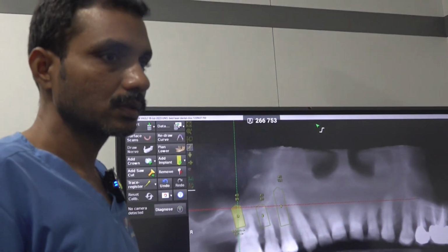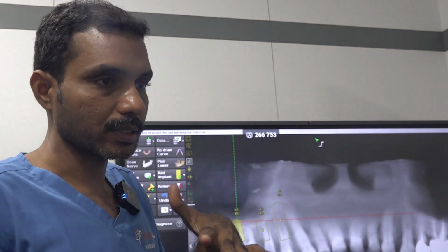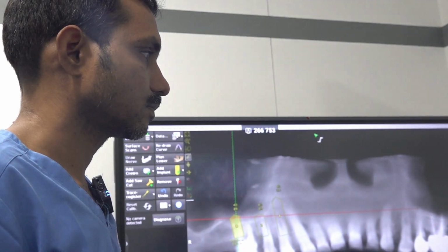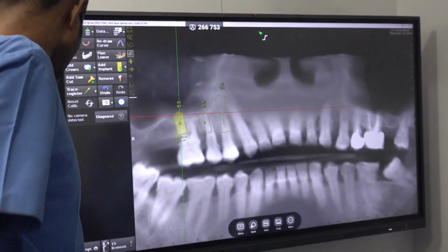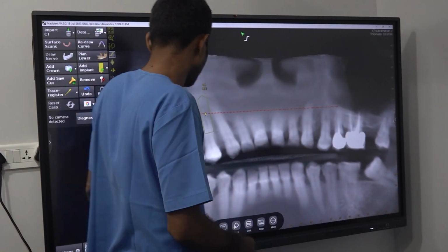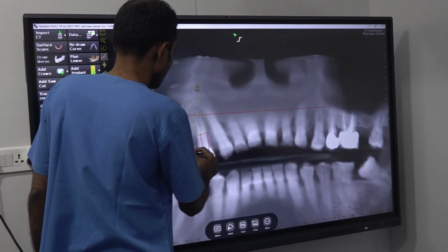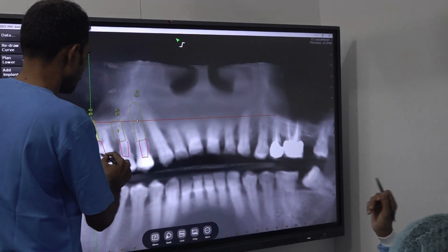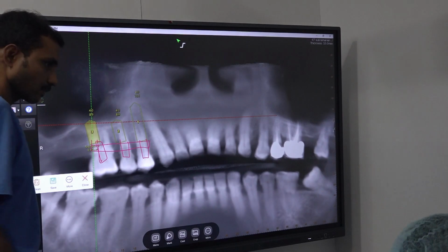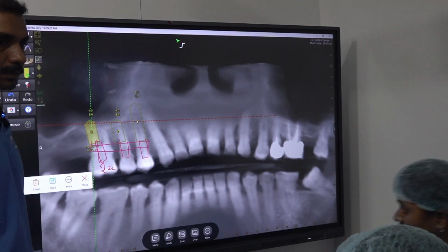In that case, do we give any splint or anything? No, nothing. Just do enough abutment preparation. So they will be eating with that. The abutment level should be below the contact, then we place the crown. I mean to say the abutment will be here. Right? Yeah, we place an implant in the same incision part, we leave it at the same level. We will do welding here, and there will be 2 mm clearance now here for abutment preparation.